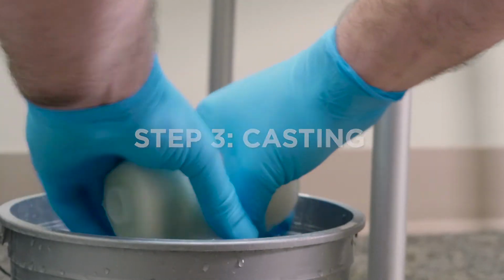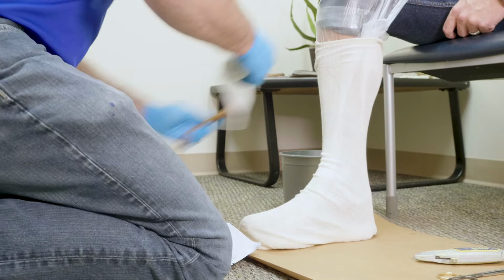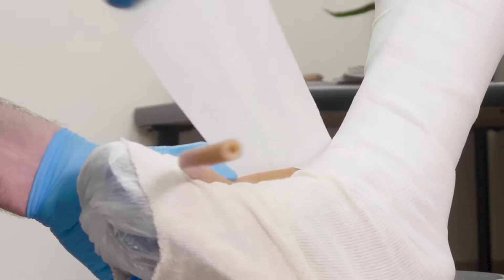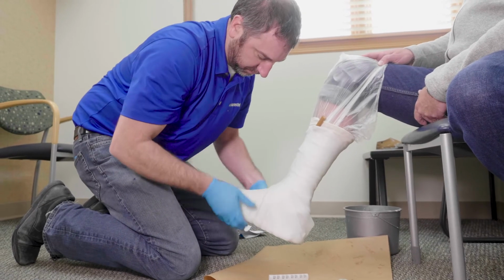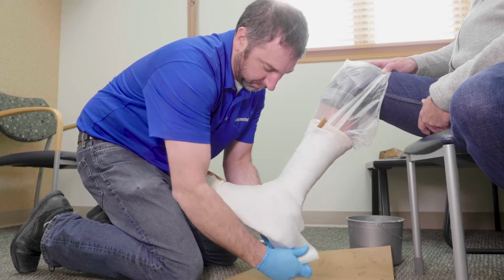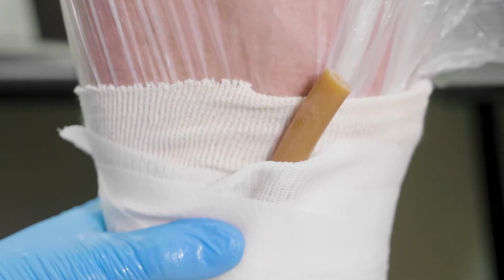Dunk the fiberglass casting material in the bucket of warm water. Squeeze the material to remove excess water. Lay the surgical tubing down along the patient's shin. With the surgical tubing in place, begin to wrap the patient's calf and foot with the fiberglass casting material, starting at the mid-calf and moving down towards the foot. Remember, the entire area needs to be wrapped with 2 layers of casting material, and the surgical tubing should remain exposed at each end of the cast.